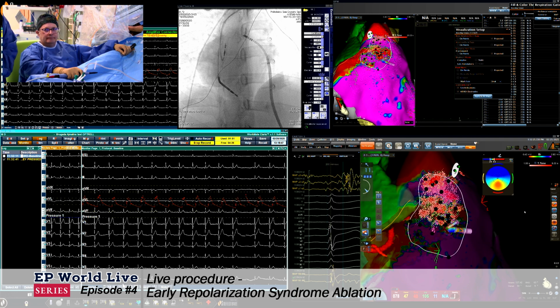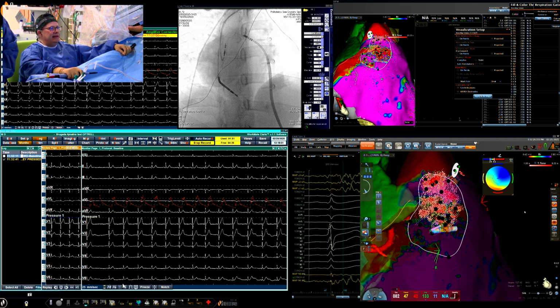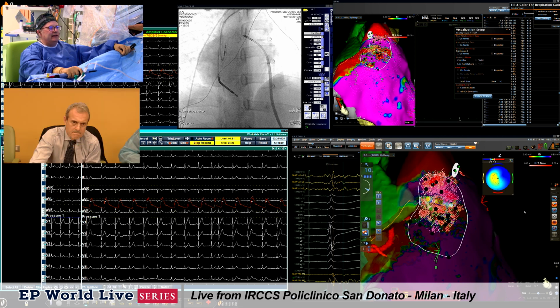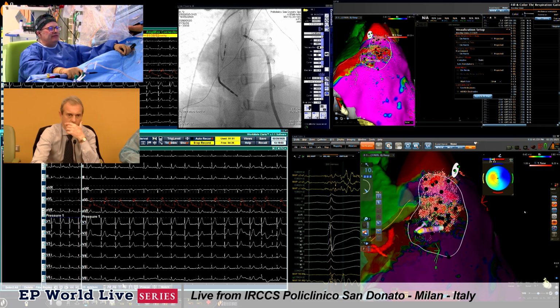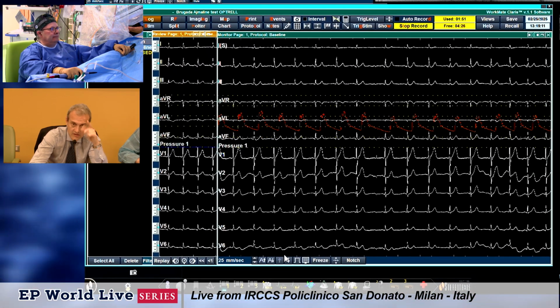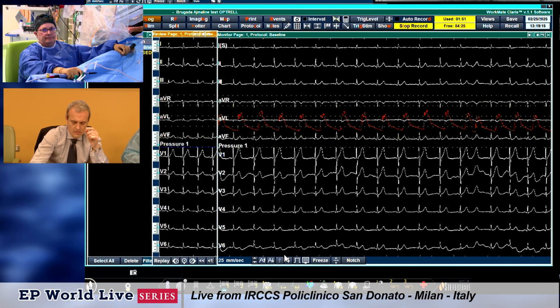Okay. Can you analyze the EKG, Giovanni? Can you comment on the EKG? We have a little ST depression in lead 2, lead 3, and AVF, clearly different from the beginning, see? Only the ECG. Giovanni, we have focused now on the ECG.